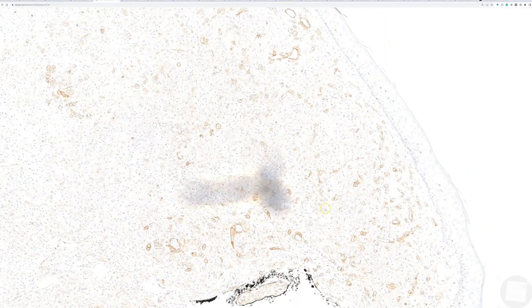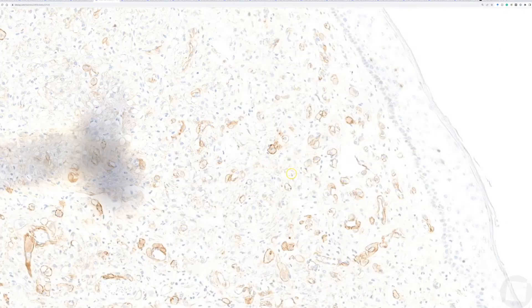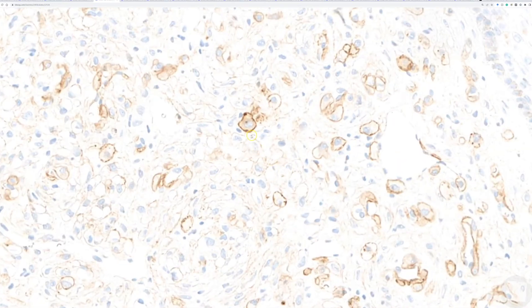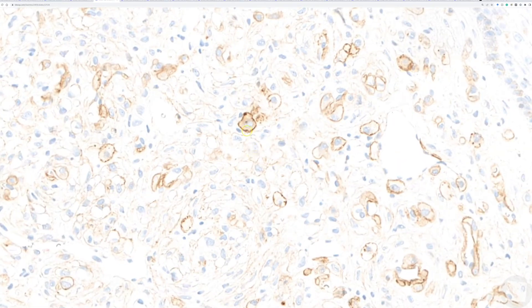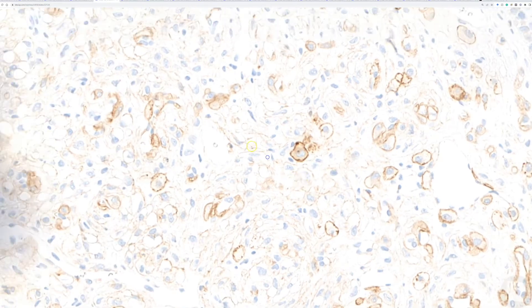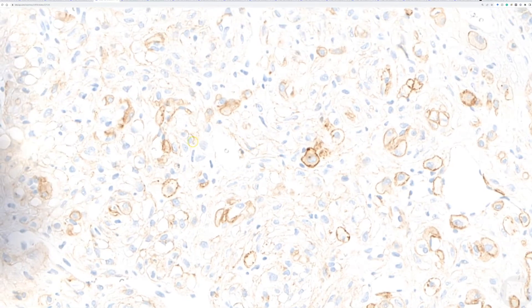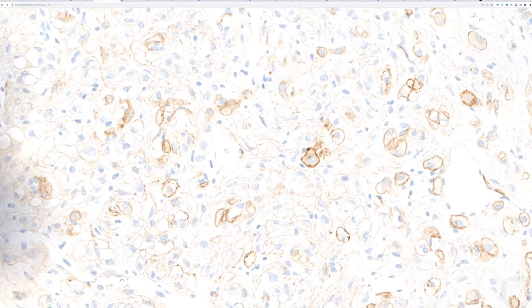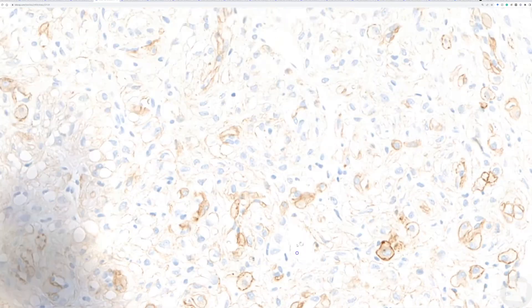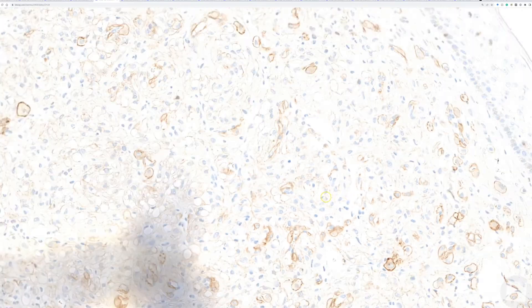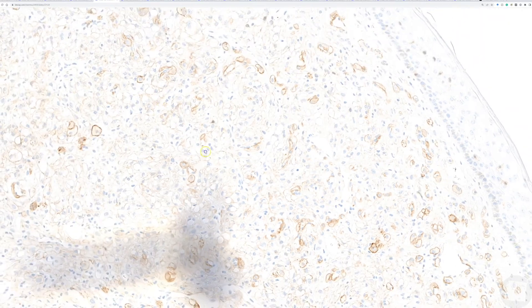It's not a terribly satisfying positivity. It's kind of weak and focal, but really crisp otherwise. It really is a stain that, in my experience, ALK1 usually has very low background staining. So, when I see even focal positivity, I would say that's probably real.